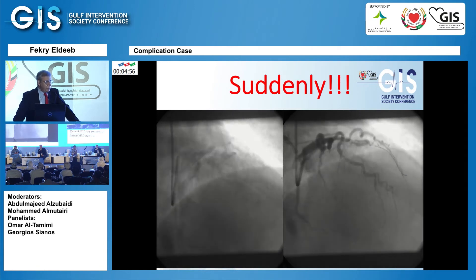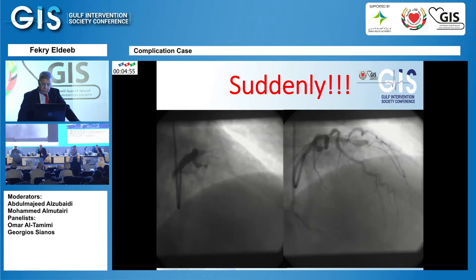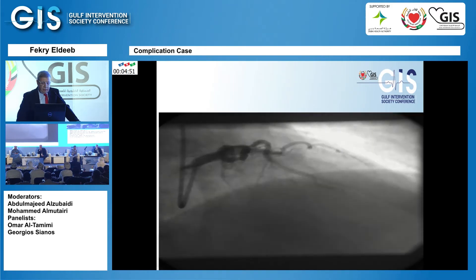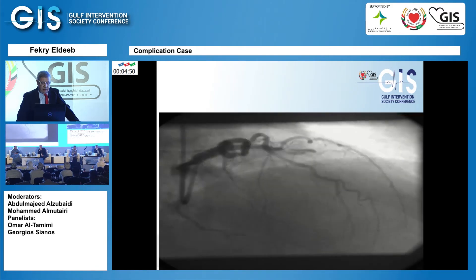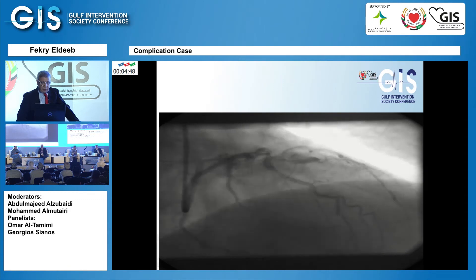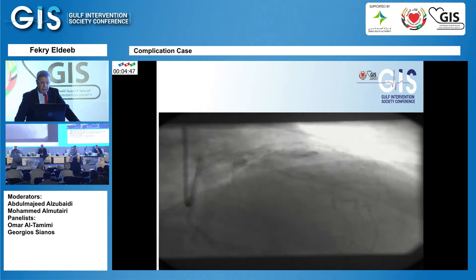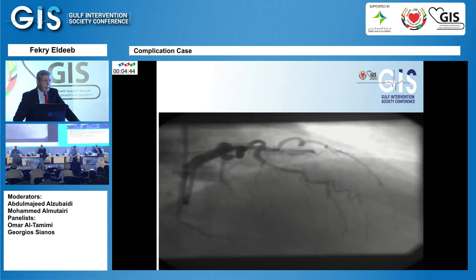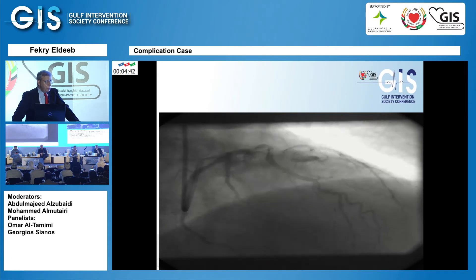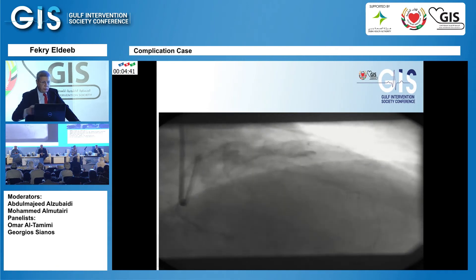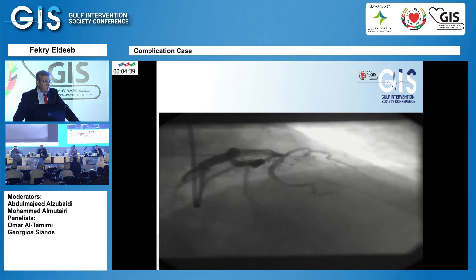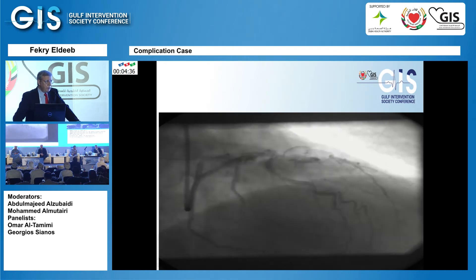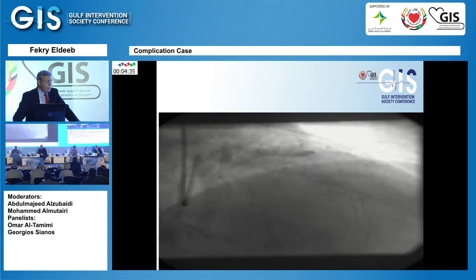I tried multiple times to advance the wire, but every time the wire was going into the false lumen. The moment I pulled the wire back, you could see the same picture again. I had to think carefully — I don't want to show you all the pictures from those attempts with different wires.